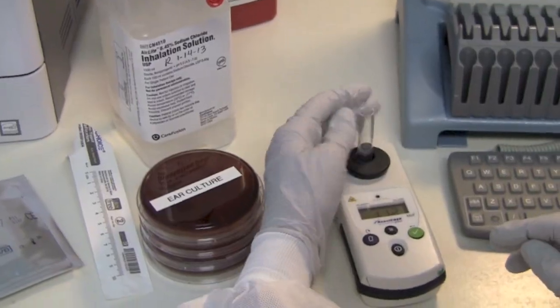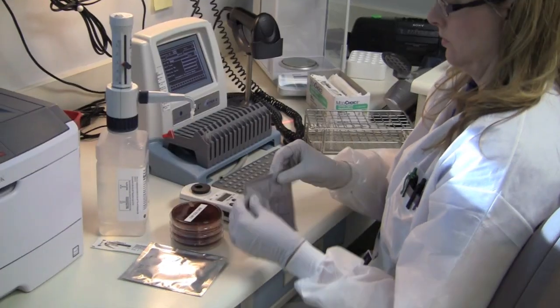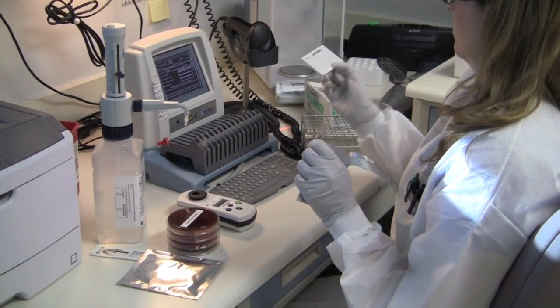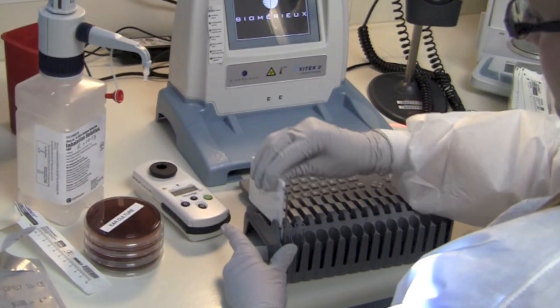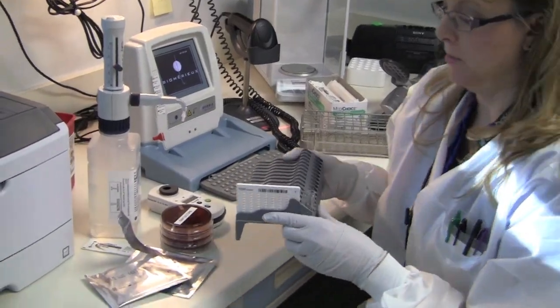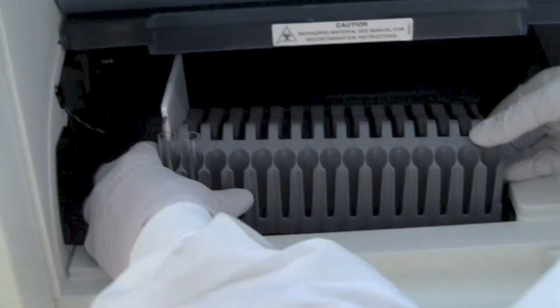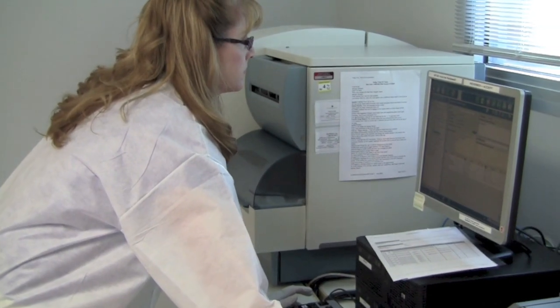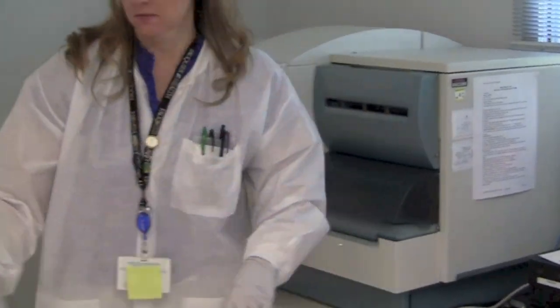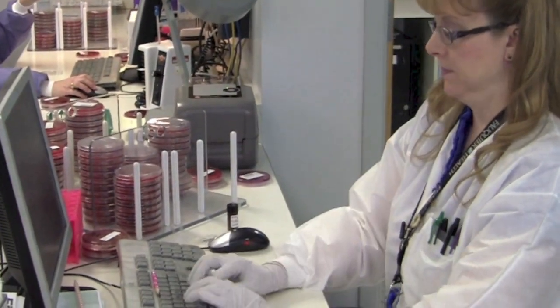A detector ensures the proper amount of dilution has occurred. A cartridge containing a panel of different antibiotics for the germ to be tested against is then placed with the test tube inside a machine that will then process the sample. The next day, the machine will provide a report of what antibiotics the infection is sensitive and resistant to, allowing a physician to provide the best antibiotic that will kill the germ.